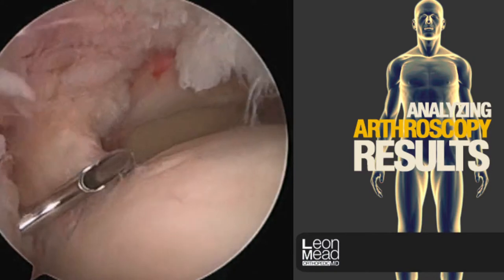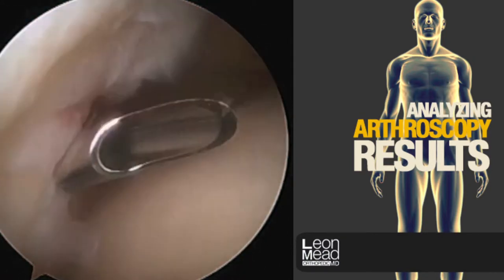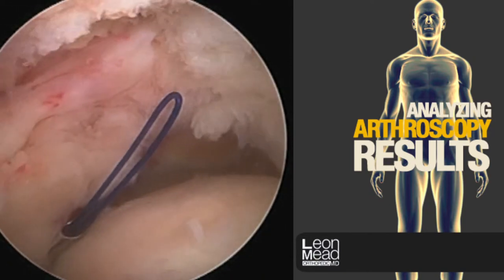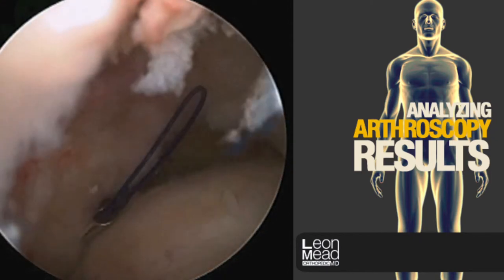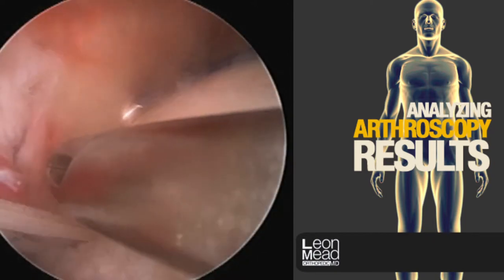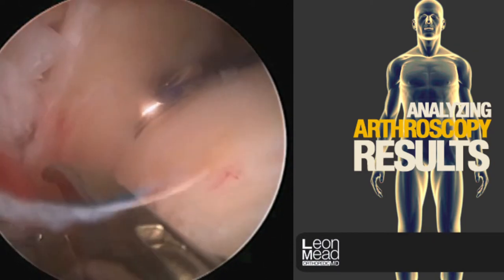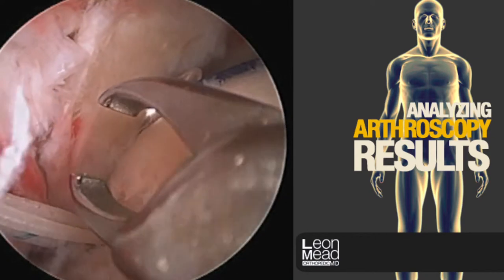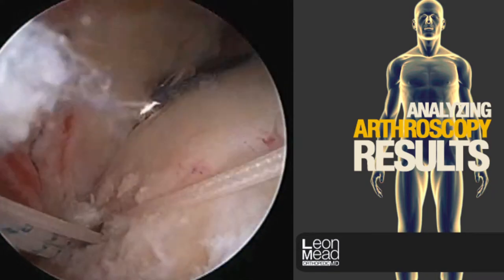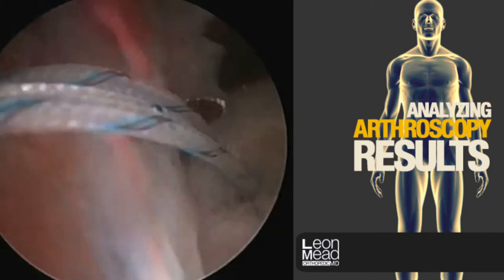The suture passer is passed through all areas of the damaged cuff. This loop of blue suture material is retrieved through a cannula. A limb of suture is retrieved through the same cannula. The suture is passed in the loop outside of the body and then is shuttled through the rotator cuff. There we see the suture that has been passed, and we're going to pass another suture limb here.